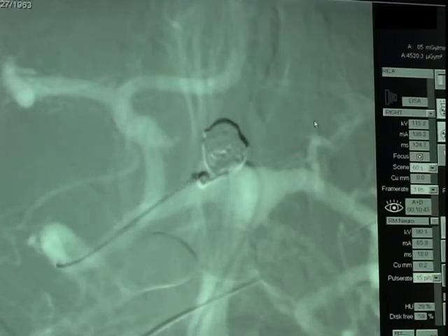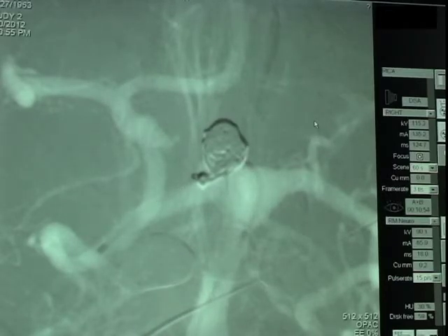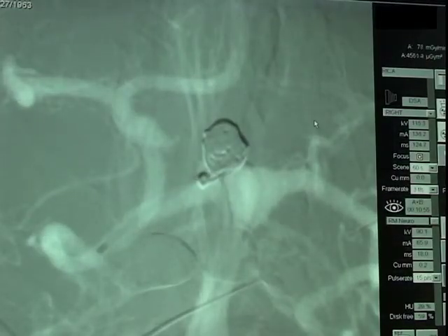The first microcatheter is already in the aneurysm, although it is difficult to visualize on this run. The delivery wire is removed from the second catheter. We will now advance a stent or neck remodeling device. It is advanced up the second catheter and across the neck of the aneurysm. Here a coil is being placed into the aneurysm first.